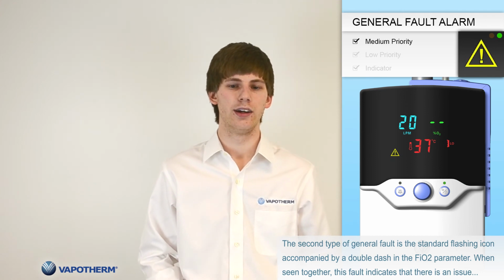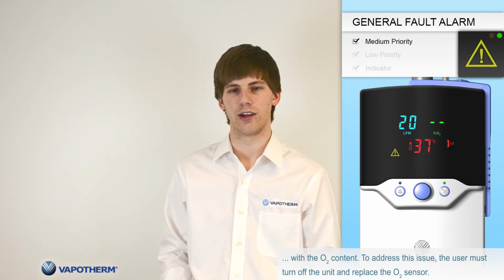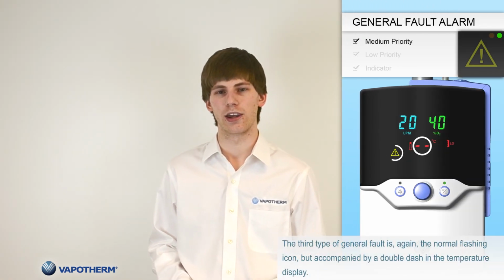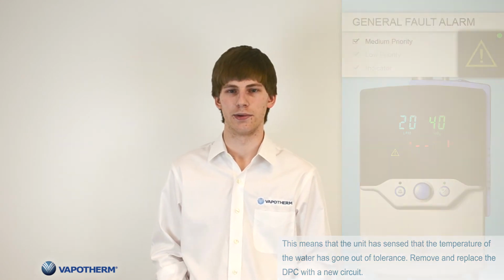The second type of general fault alarm is a standard flashing icon accompanied with a double dash and a FiO2 parameter. When seen together, this fault indicates that there is an issue with the O2 content. To address this issue, the user must turn off the unit and replace the O2 sensor. The third type of general fault alarm is again the standard flashing icon, but accompanied with a double dash and the temperature readout. This means that the unit has detected that the temperature of the water has gone out of tolerance. To remedy this, remove and replace the DPC.